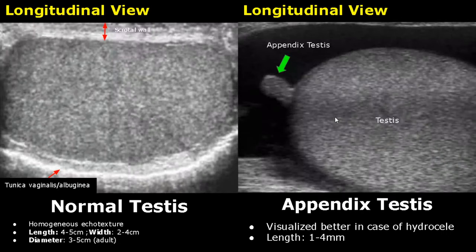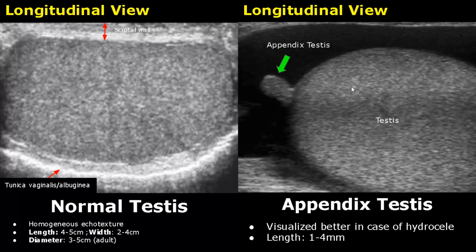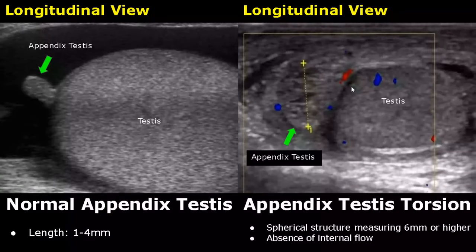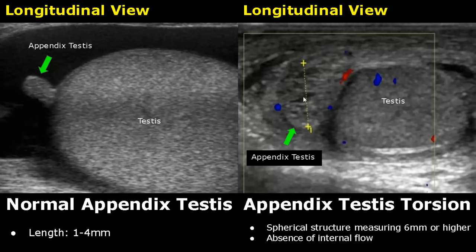Appendix testis is an accessory testicular tissue found between the upper pole of the testes and the head of the epididymis. It is more easily visualized when there is a hydrocele and can measure 1 to 4 millimeters in length. In torsion of appendix testis it is enlarged and can measure 6 millimeters or more. There will be absence of internal flow on Doppler, which is a feature that tells us there is torsion of the appendix testis.